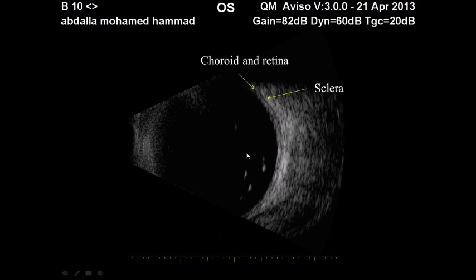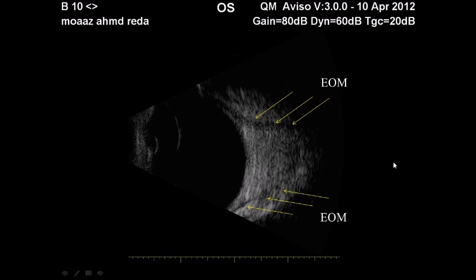In this example, the vitreous cavity shows some echoes, and we can see the normal choroid and retina, then the hyperreflective sclera and the loose connective tissue of the orbit. In this next example, you can see in the orbital cavity we have two low-reflective zones coming from behind, parallel to the globe — these are two extraocular muscles.